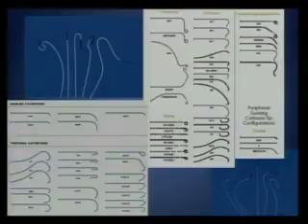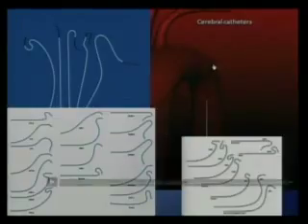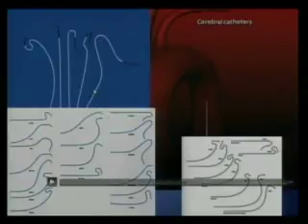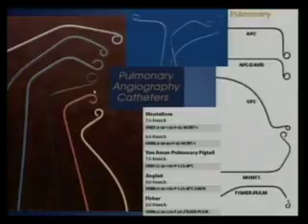Sizing catheter means these catheters actually have marks on them. So these marks help you to realize how big that vessel is. So these are the cerebral catheters. Cerebral shapes are very different from shapes used in the visceral. So when you need to know what your target vessel is, use the right shape of catheter. And you also need to know the anatomy of that vessel to use the right shape of catheter. Okay? These are the pulmonary angiocatheters to gain access to the pulmonary arteries.